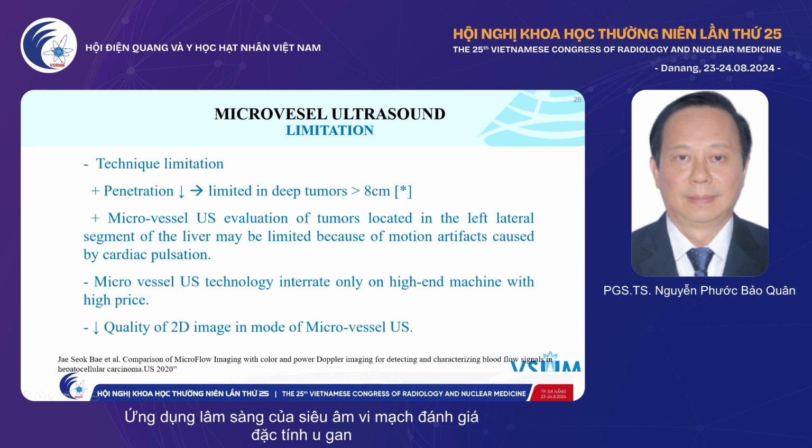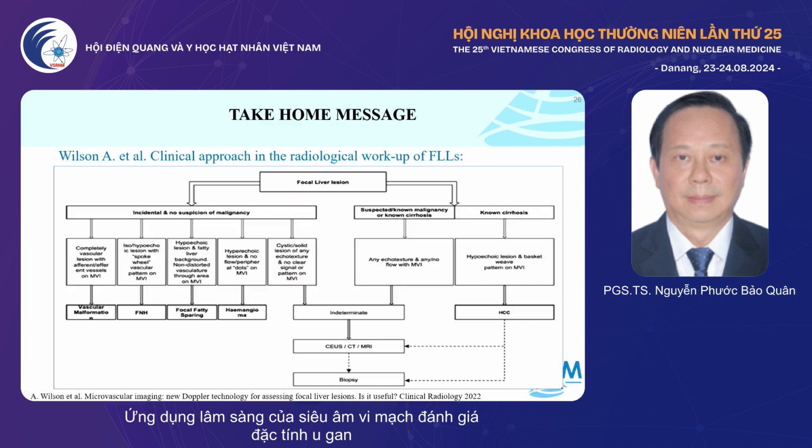And anyway, microvascular ultrasound technology is integrated only in high-end machines. So I hope in the future the technique can be integrated in low-end machines, so it becomes popular for us to investigate the microvessels of tumors.